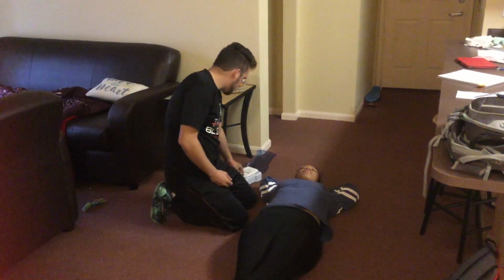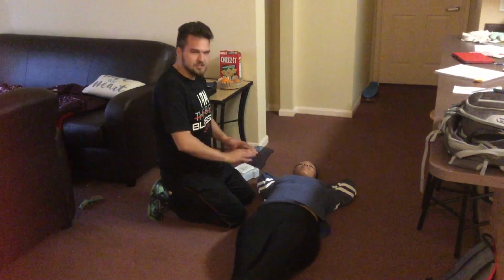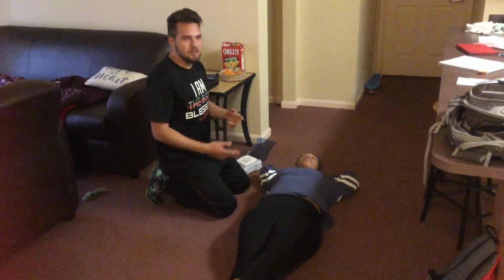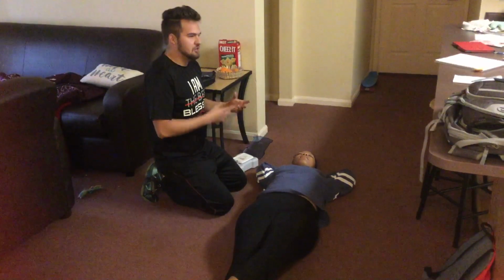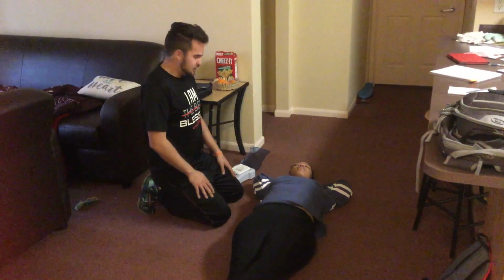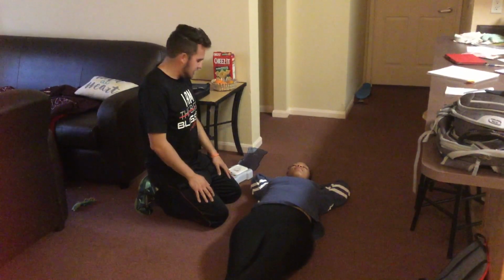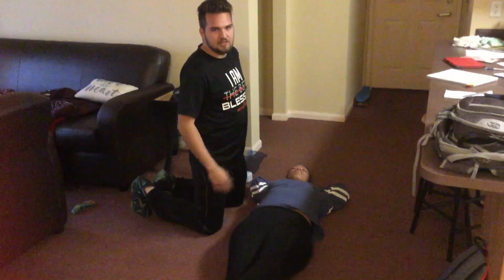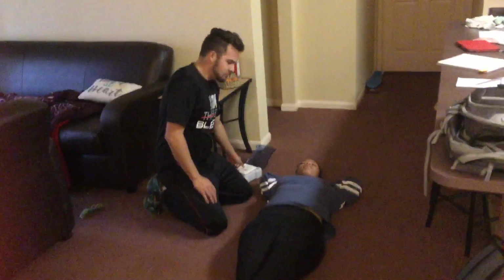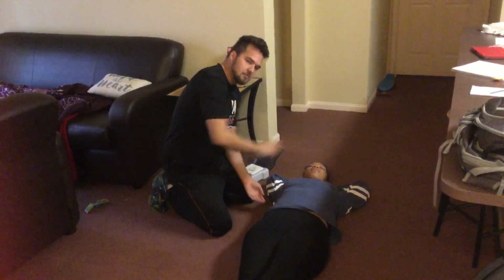Before I grab the AED and start, I'm looking for a few things. If it's someone under 2 years of age, I wouldn't use the AED, just CPR and rescue breaths. I'm looking for a pacemaker, because if they have a pacemaker, they're already trying to regulate their own heartbeat. It's already its own defibrillator, so I wouldn't use it for that. Also any metal. And if there was a young toddler or some kind of way I couldn't put the pads on the way it's shown, I would even try a top-to-bottom placement, encasing that heart, one on the top, one on the back.